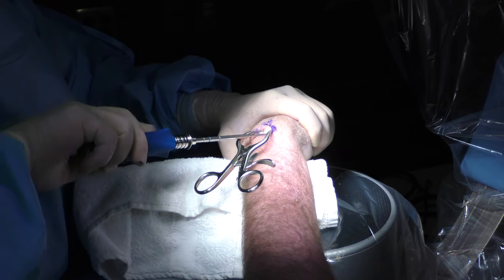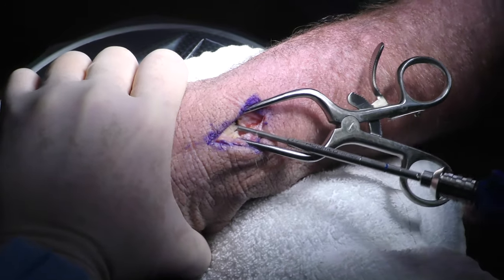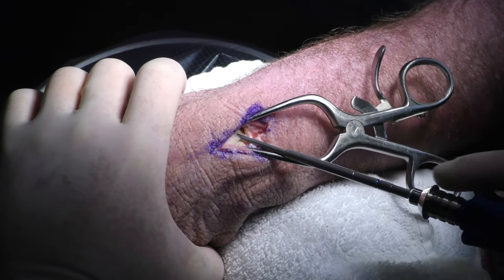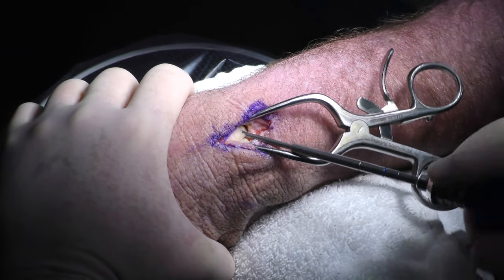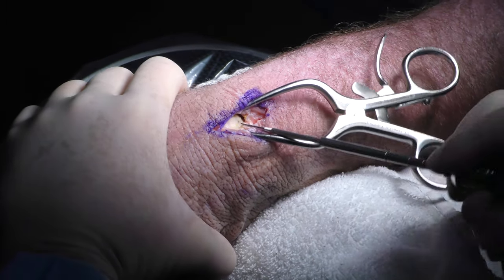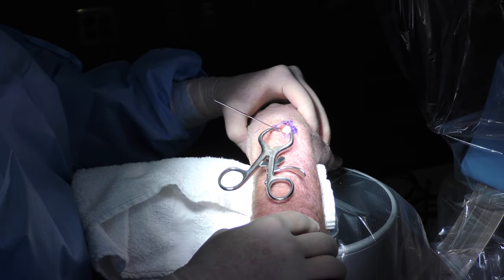And you want to bury this below the articular surface. When you finish seating it, if you can no longer see that part of the screwdriver, you are probably in deep enough. You can take your screwdriver off. You can always reapply it. Wiggle it a little bit, it slides off, and you can slide it back down. If you feel you need that half more turn, then you can take it out, and you have your wire driver back on. You can take a picture before you take your wire out, to make sure that you didn't put it in too far, and it doesn't look like we did.